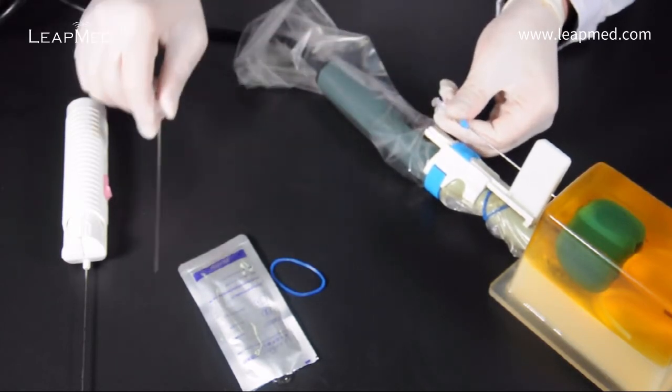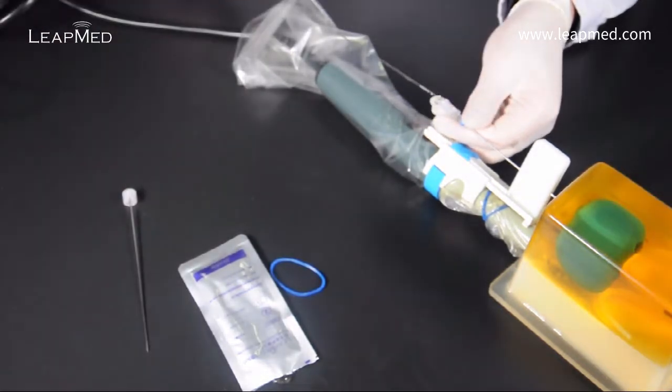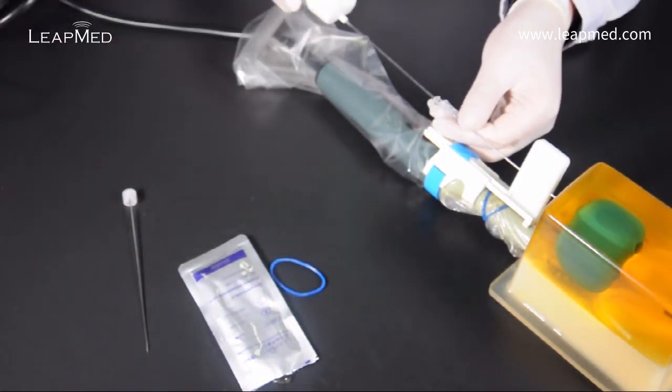Remove the inner needle of the coaxial. Use the biopsy needle to go through the introducer and conduct the biopsy.